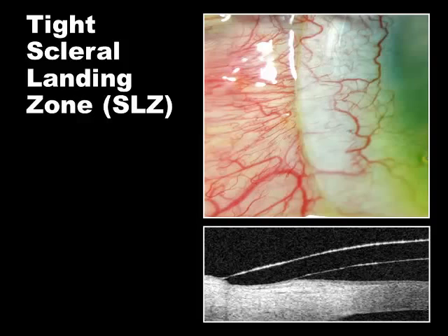Now, why minus? Anytime you reduce sagittal depth in an ICD, it's a minus adjustment. If we increase edge lift in any contact lens, that takes away sagittal depth. It subtracts sagittal depth. So scleral landing zone -1 increases the edge lift and decreases the central sag slightly.